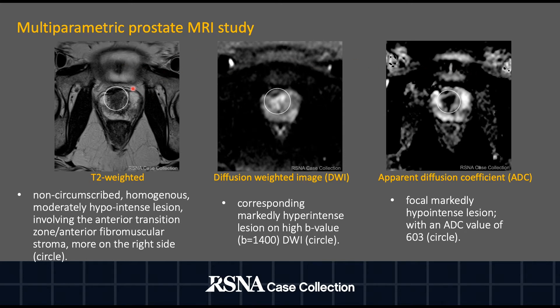We can see here, circled on the T2 weighted image, a non-circumscribed hypo-intense lesion involving the anterior transition zone, and this measured 1.8 centimeters maximally. Looking at the high B value DWI, we see that this lesion is hyper-intense, and on the ADC map there's corresponding marked hypo-intense signal. This high signal on the high B value DWI with corresponding low signal on the ADC map is indicative of restricted diffusion.